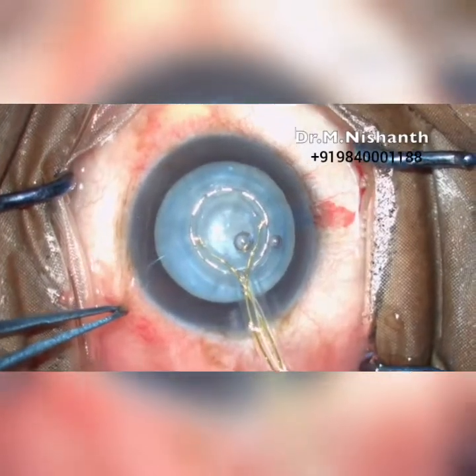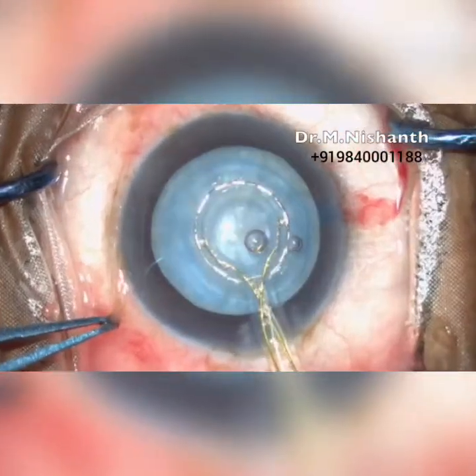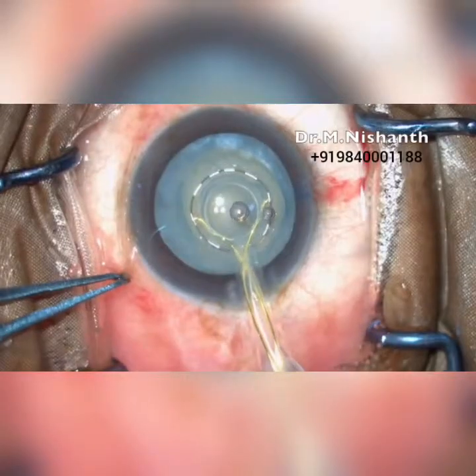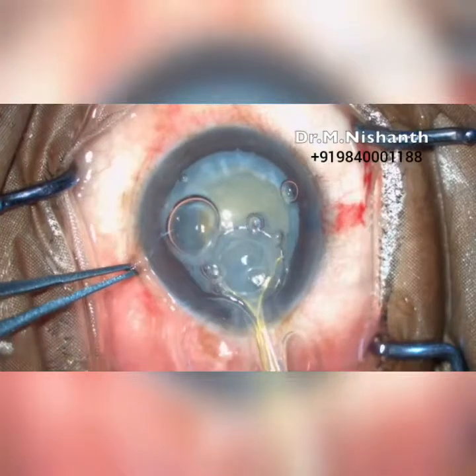Precision pulse technology is used to cause a rapid phase transition of the water molecules underneath the ring, cleaving the capsule membrane and simultaneously creating 360 degrees of capsulotomy. Then the vacuum can be released and the tip collapsed and removed through the main incision.